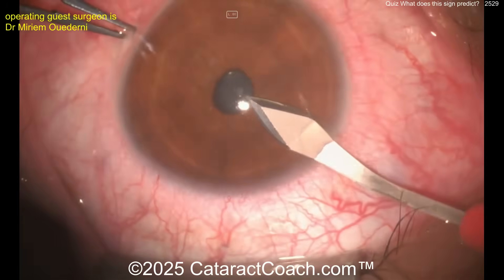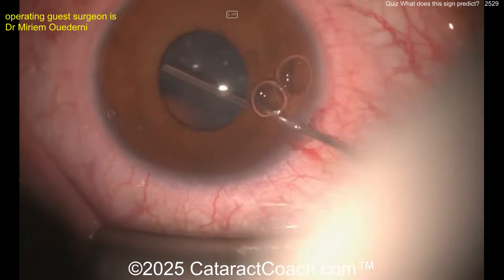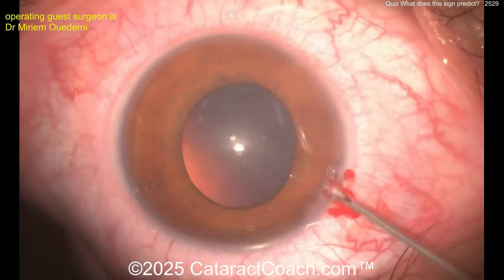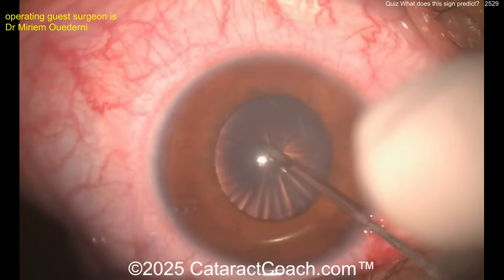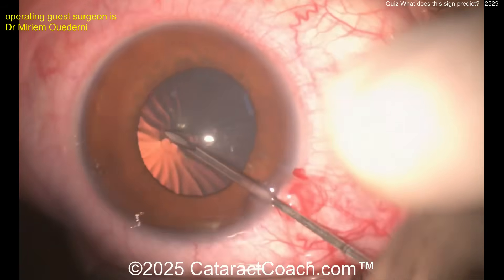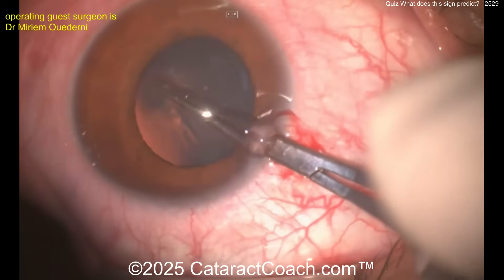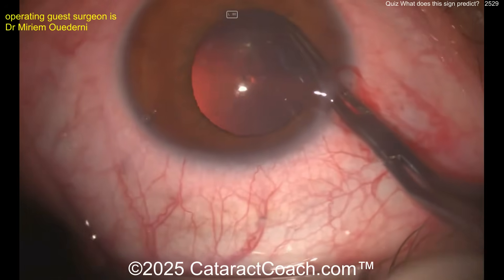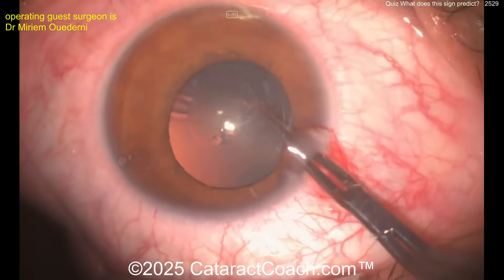Let's watch the case. Starting off with an incision, putting viscoelastic in, getting some viscodilation and viscomydriasis. Now look at the needle poking in to start a cystotome rhexis — and that is really bad zonulopathy. Losing all your support means the anterior capsule is going to wrinkle and you get those radial wrinkles when you're trying to enter the capsule.